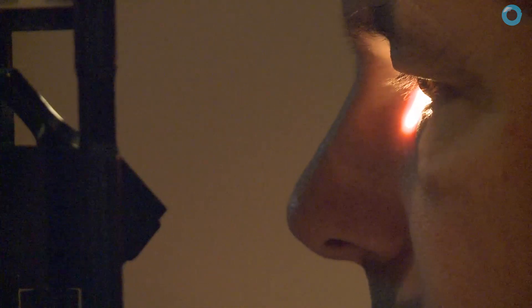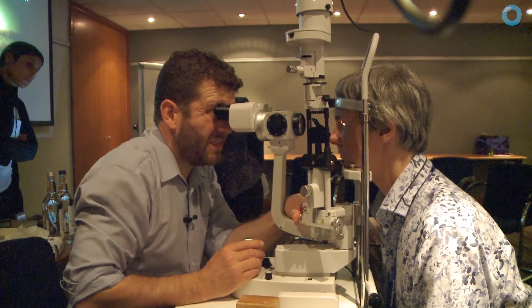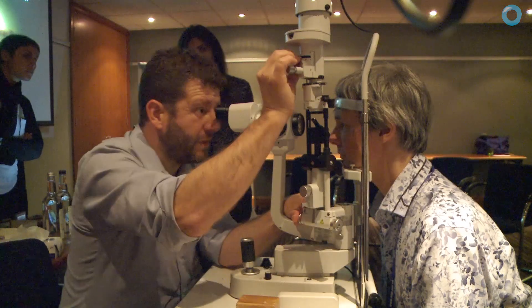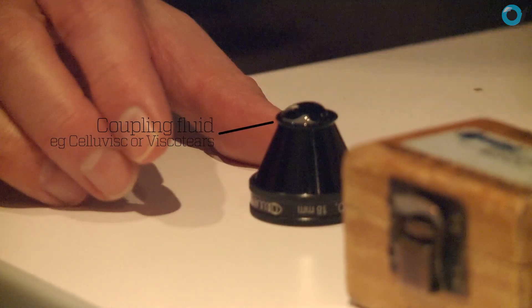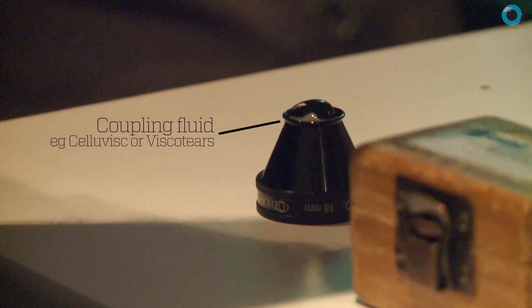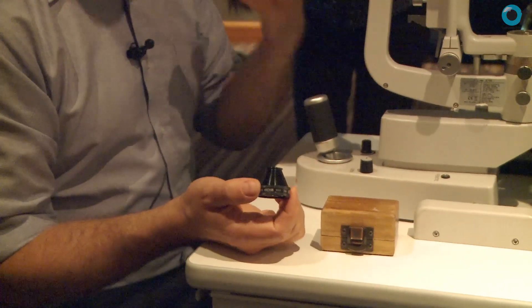For looking at the front of the eye I always try and have a look first — so just do a simple Van Herrick type limbal anterior chamber depth assessment with a relatively short beam and a very very narrow bright beam. Then take the gonioscope with lots of whatever coupling fluid you're using — it wants to be something that stays there if you turn the lens upside down. If it's too liquid it will just drop off and make life awkward.